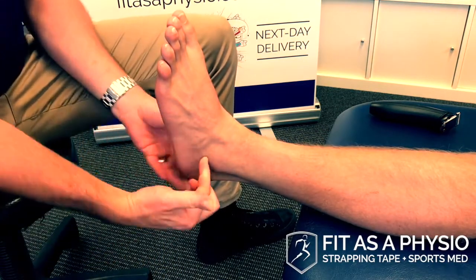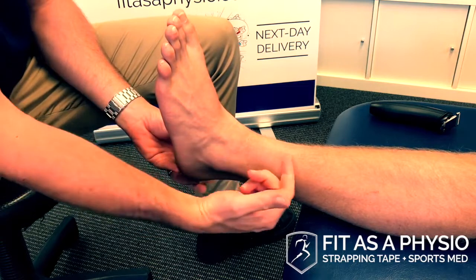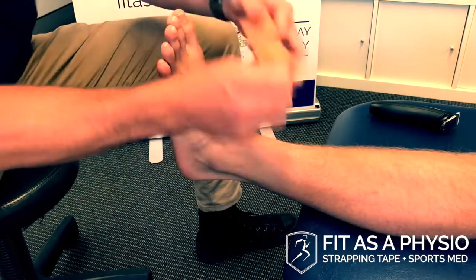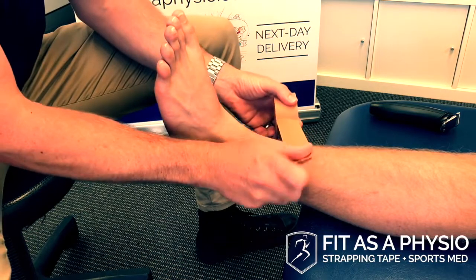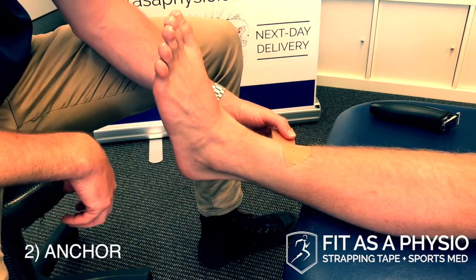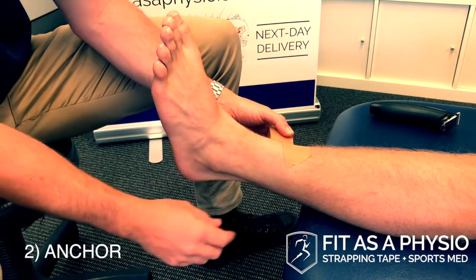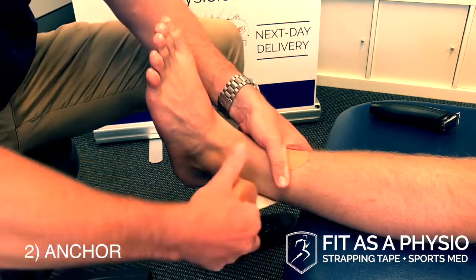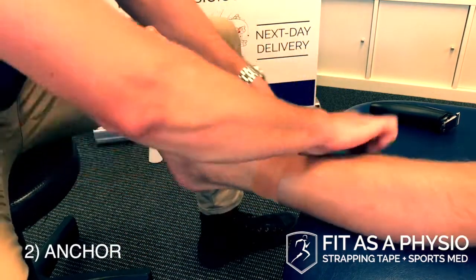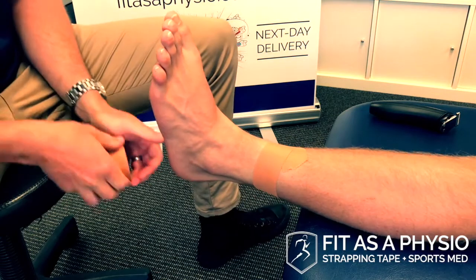I'm looking for about a third of the way up his leg — a third of the distance between his ankle and his knee. I'm laying on an anchor at an angle because the leg is conical; angling the tape down means it comes back up to where we started. So that's our anchor.